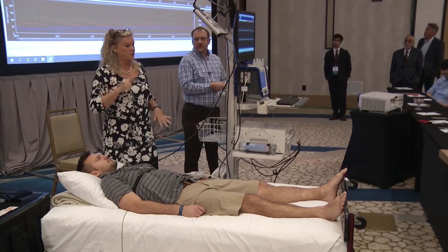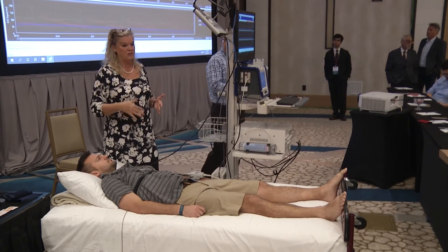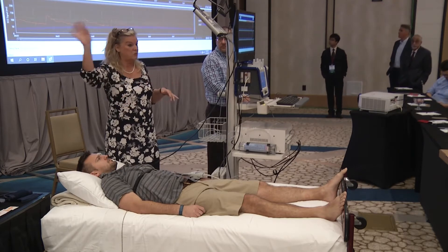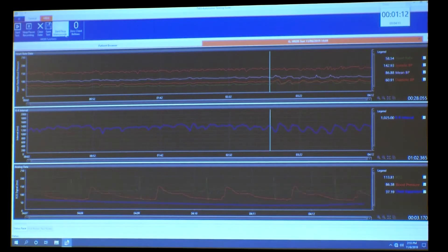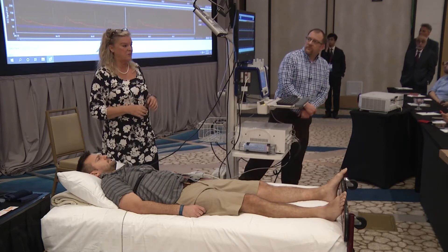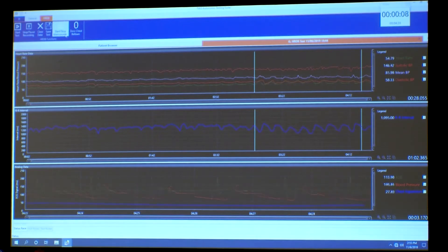I've actually had diabetic patients really wander off and had to call for respiratory assistance. You really need to watch them, because after the second set, if they don't get it in the first couple of breaths, you're doing three or four sets. On a diabetic or somebody with compromised autonomic function you'll be able to see it on the screen — they'll have nice big deep variations and then they start to get smaller. These patients can get lightheaded.